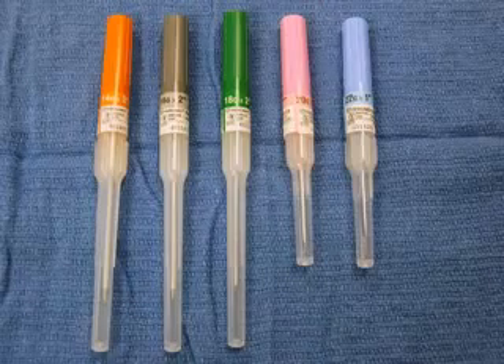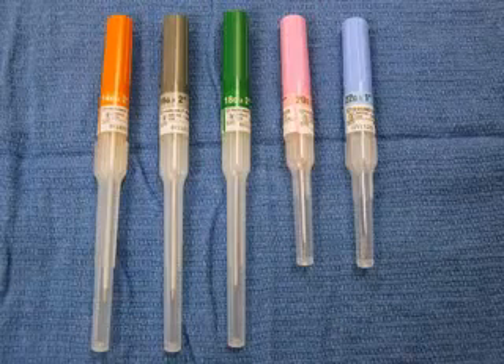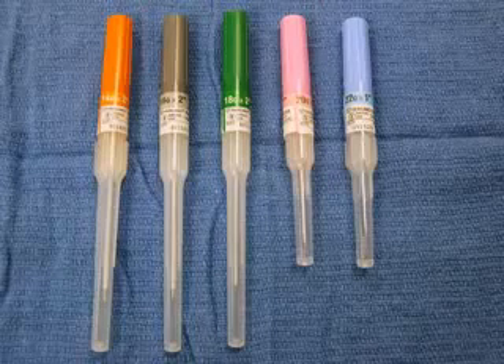Intravenous catheter sizes are indicated by the colored case and same colored hub. An 18-gauge green catheter is often appropriate for adults.